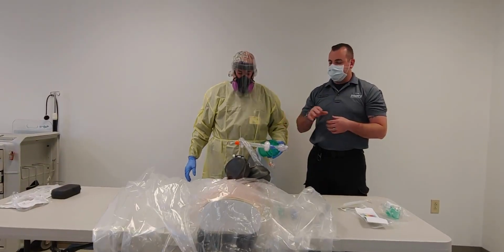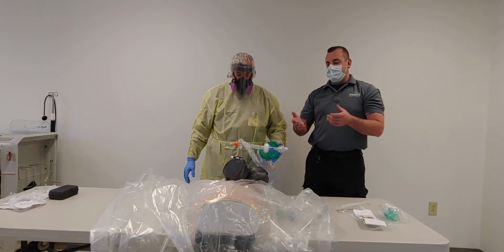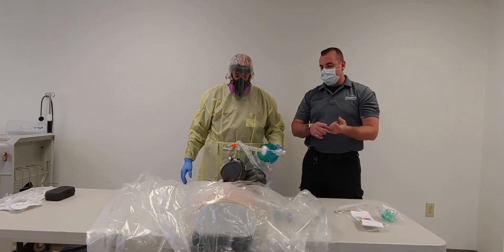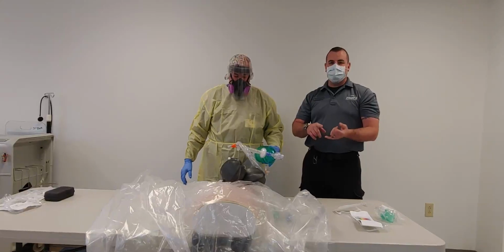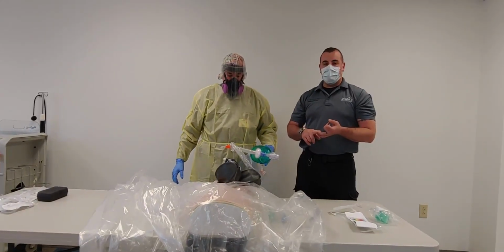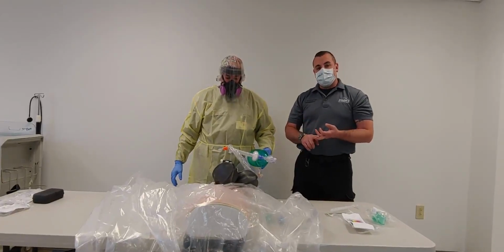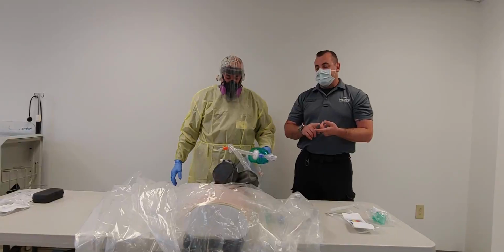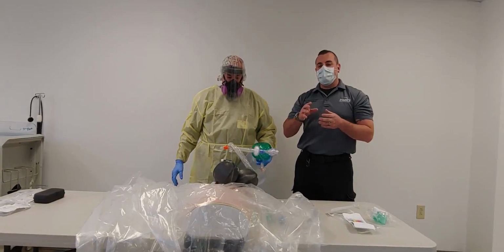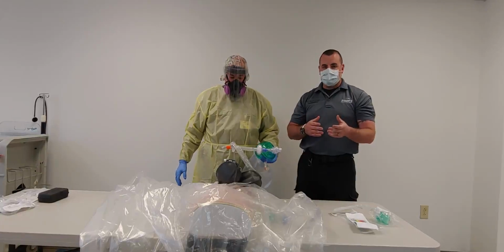On the pre-hospital side, the ALS side, we're going to use the setup just how we see it here. And then you would go through all your intubation confirmation methods like you normally would. You want negative epigastric sounds, positive lung fields equal throughout both sides. We'll make sure we didn't go too deep. We're also going to look for a positive end-tidal CO2 waveform. If you have a pulse ox attached, you want to try and get a pleth waveform if you can, which our monitors do, so that we can confirm it's accurate.